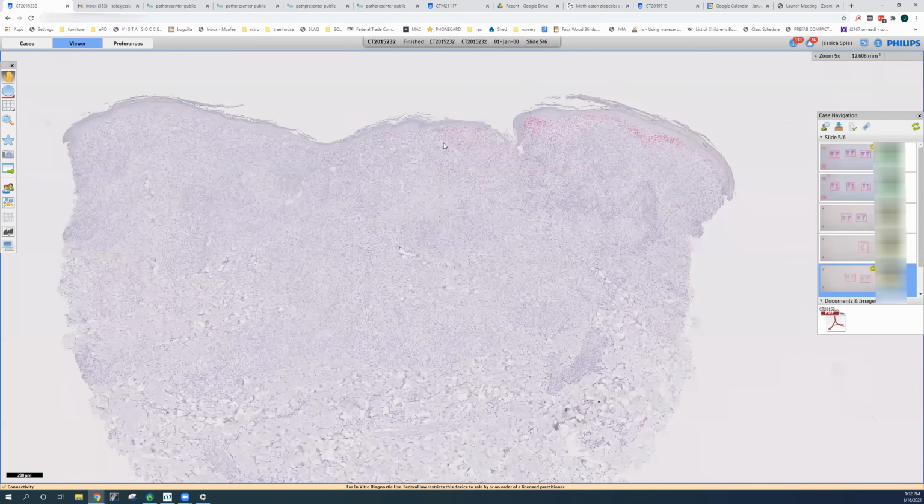In secondary syphilis, the rash of secondary syphilis, you can get spongiosis, you can get psoriasiform epidermal hyperplasia, you can get frank granuloma formation, especially in older lesions. None of those things we really see here. This is really a more run-of-the-mill lichenoid variant.